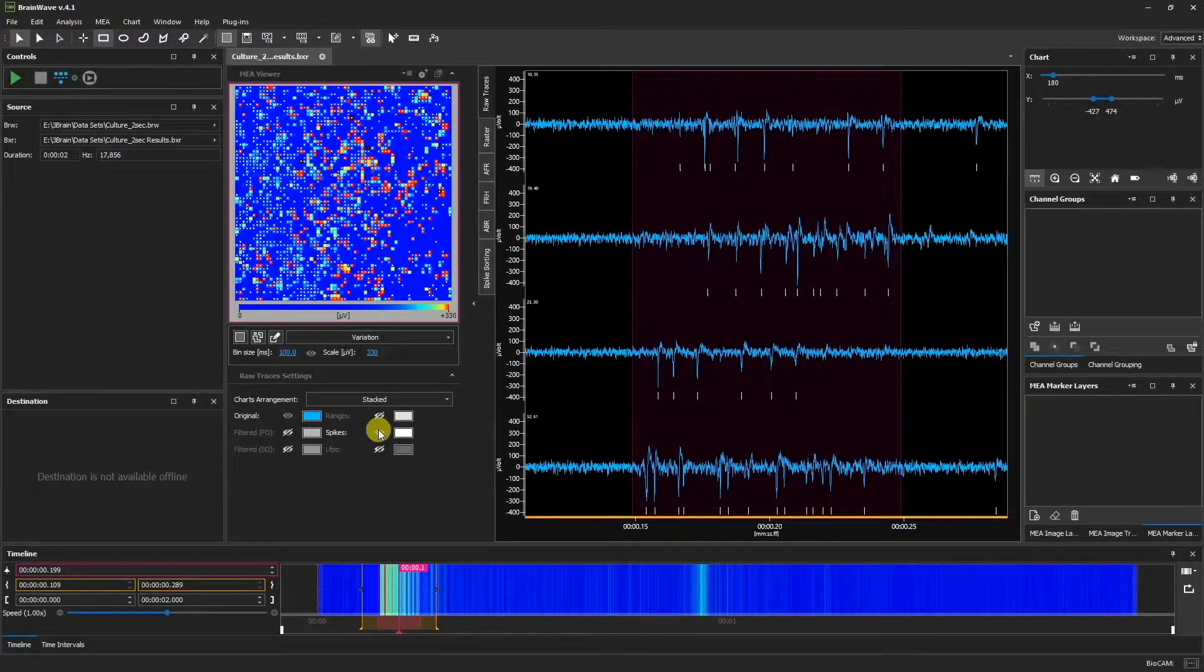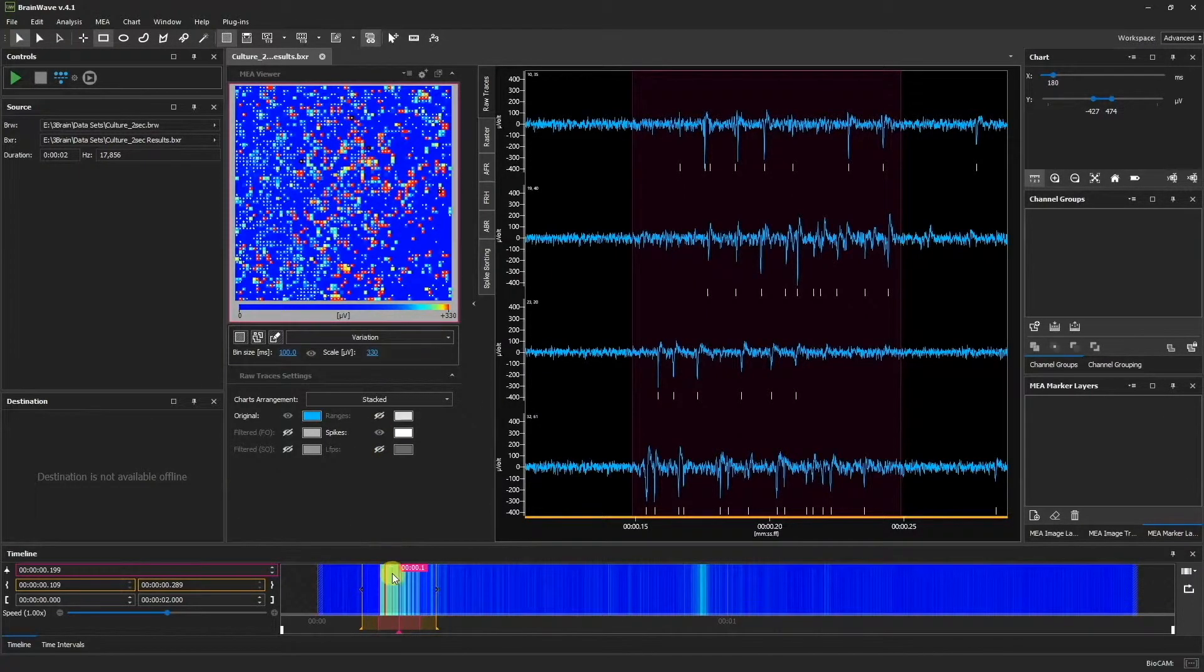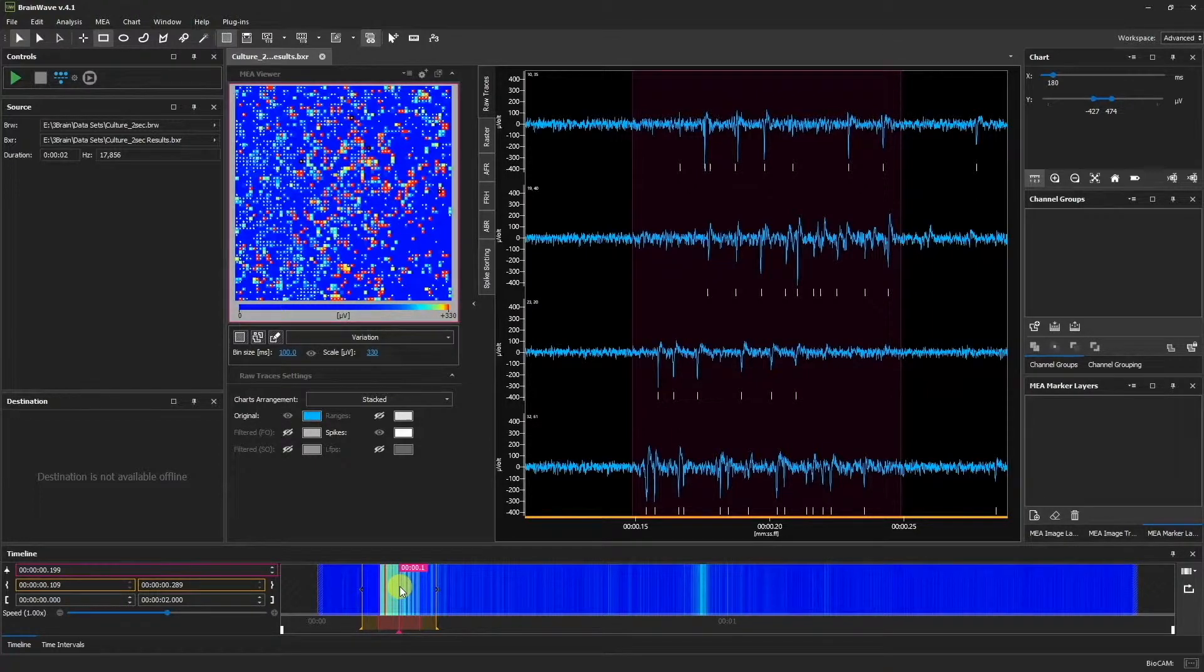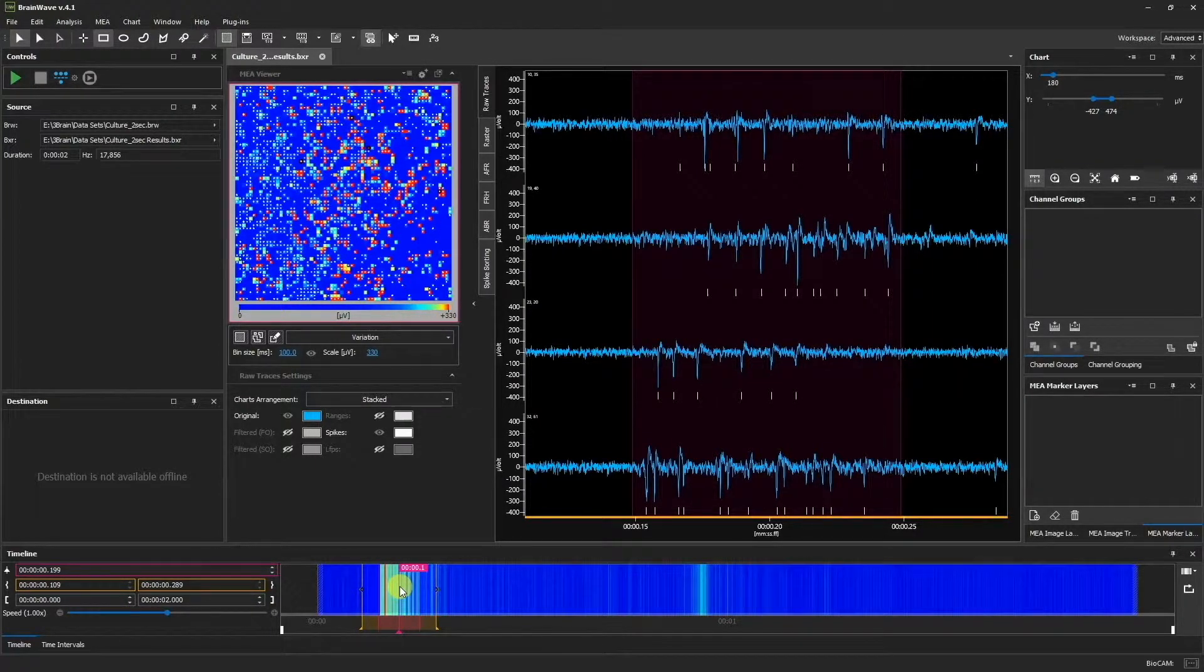Meanwhile, if we look at the timeline, we can see the mean firing rate, which is the number of spikes per second calculated from each electrode.